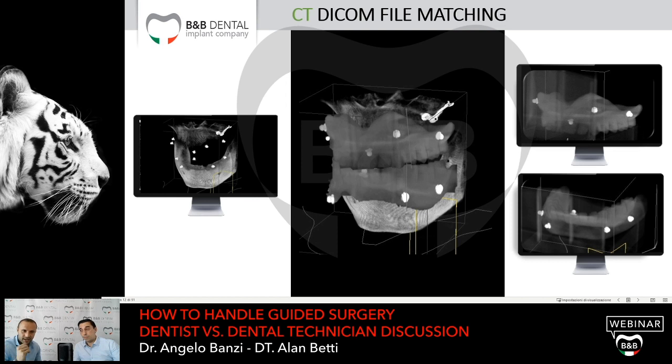It's very little in this case, but it can create a deformation, more a swelling of the image, and the final fitting position of the surgical template can be a problem. So it's very important to check the material you are going to use to rebase.